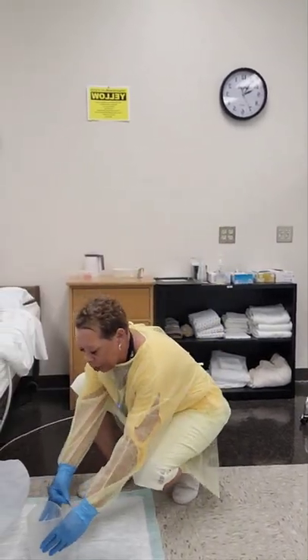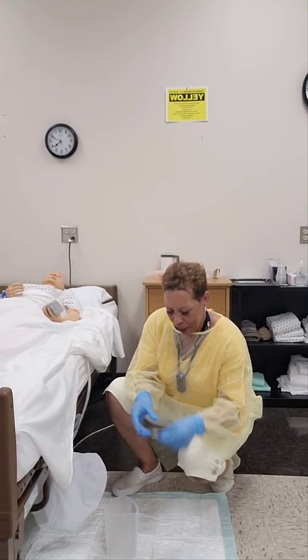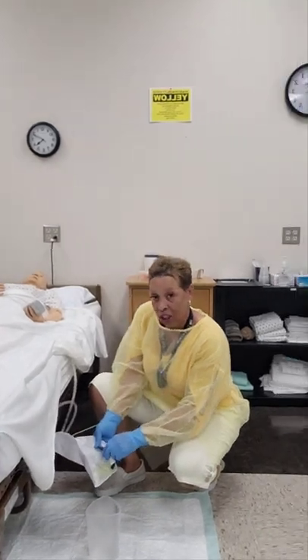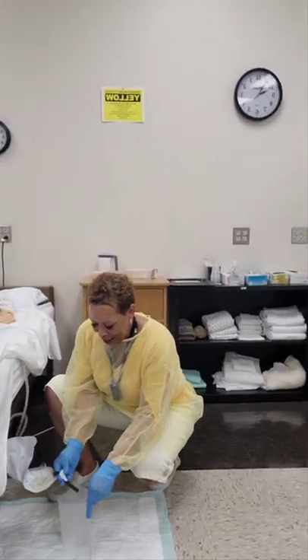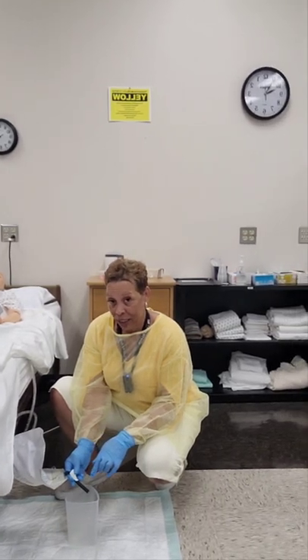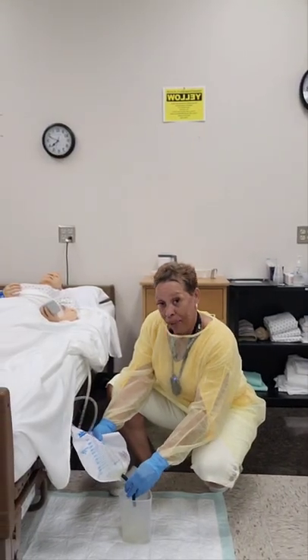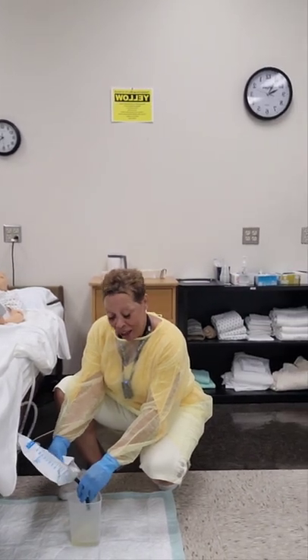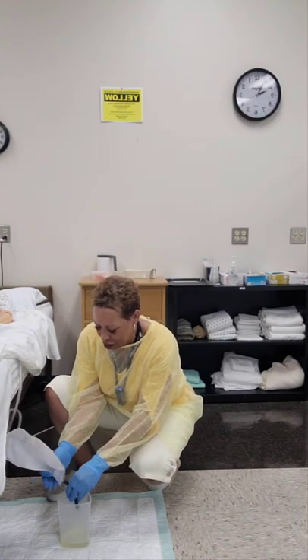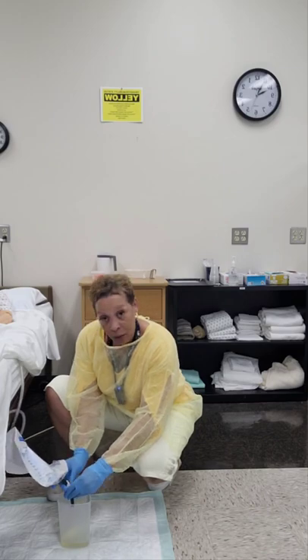I'm going to place these supplies on the clean barrier and prep my alcohol wipe by opening it up and placing it on the clean barrier. The next thing I'm going to do is remove the drainage tube from the holster, place it inside the measuring container making sure it does not touch any area on the inside of the container. I'm going to open the drain and drain the urine, making sure no parts of the tube touch the inside of the measuring container. I'm milking the bag to ensure all the urine is drained. Once all the urine is drained, I'm going to close the drain or clamp.